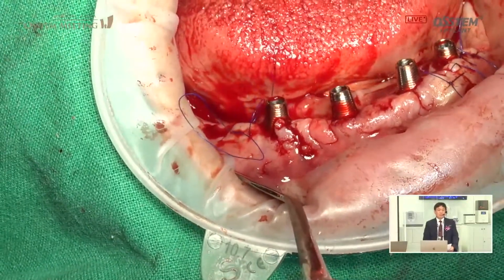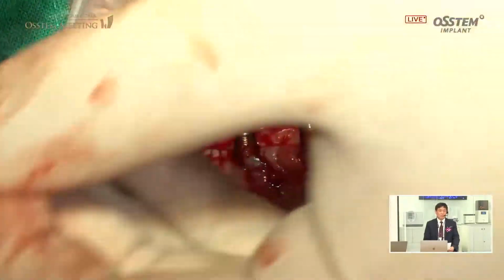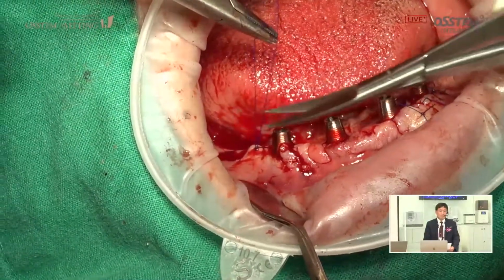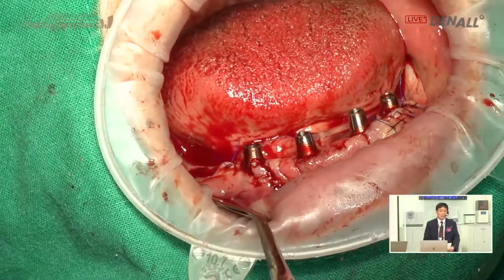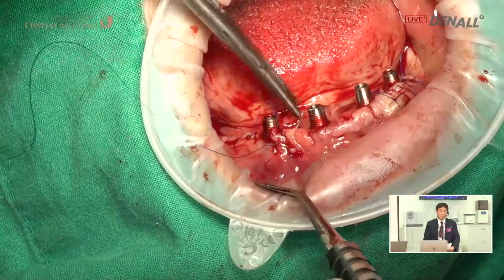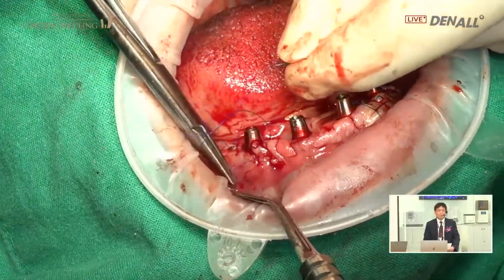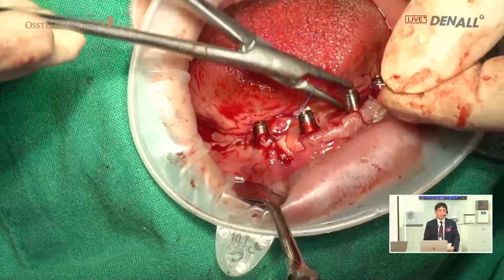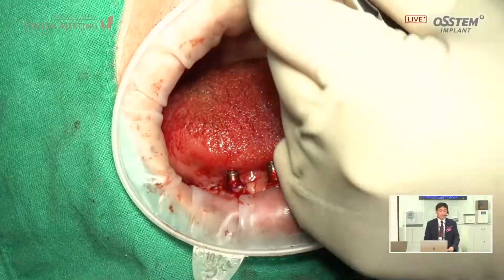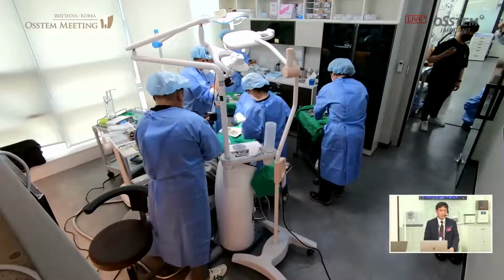If you have bone loss in the mandible, as was presented before, the implants can be placed in the mandibular posterior, but to provide a vertical step as an initial stage, OneGuide surgery is being done to place implants. We try to find an appropriate patient for this indication, and the surgery is smoothly progressing.